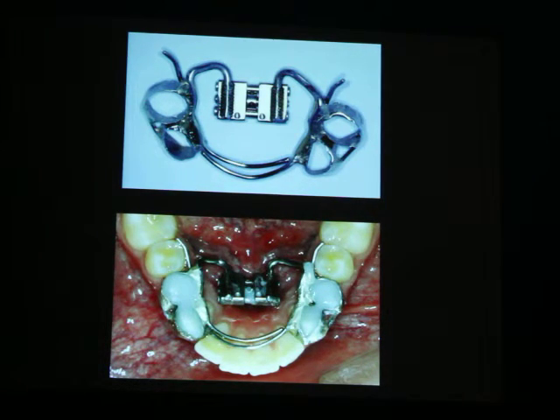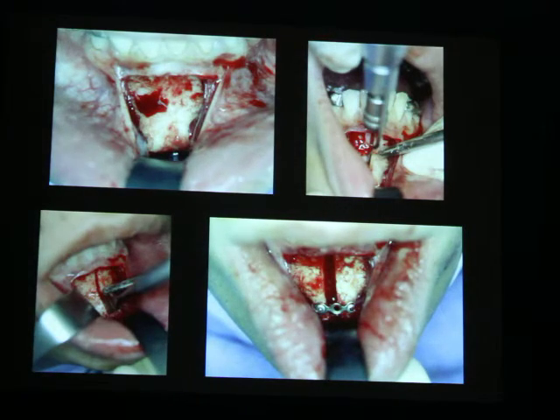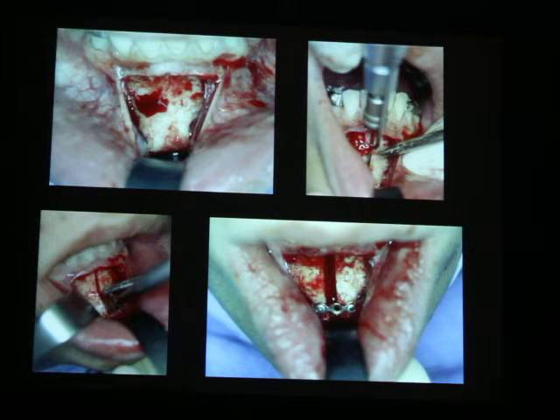When I treated this patient at that time, we didn't have mandibular screws for distraction osteogenesis, so we had to make them ourselves with our technician. We could not have done it without a very good technician. You see, the surgeon made this vertical osteotomy cut at the level of the mandibular symphysis, right through the chin.